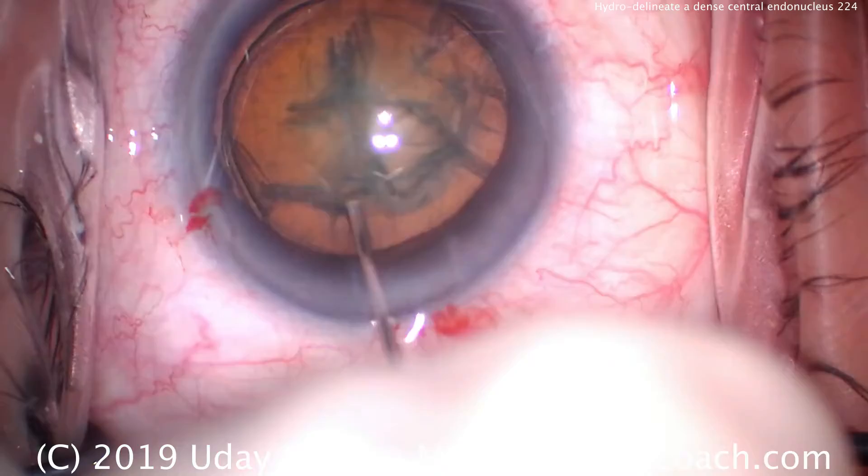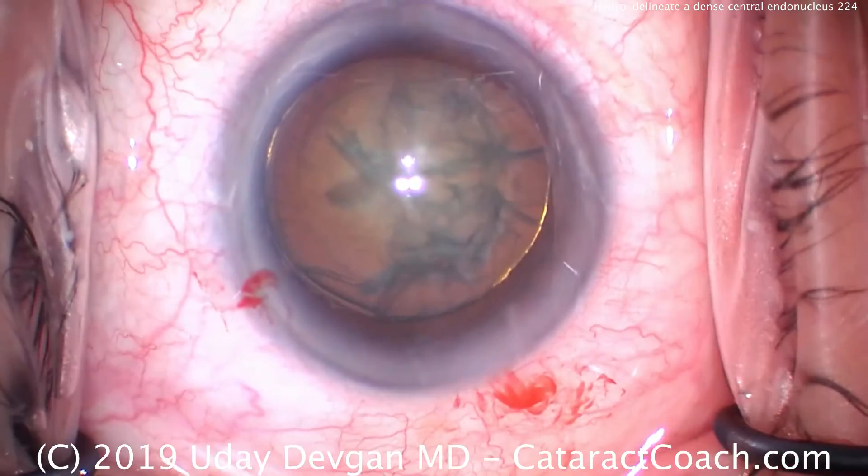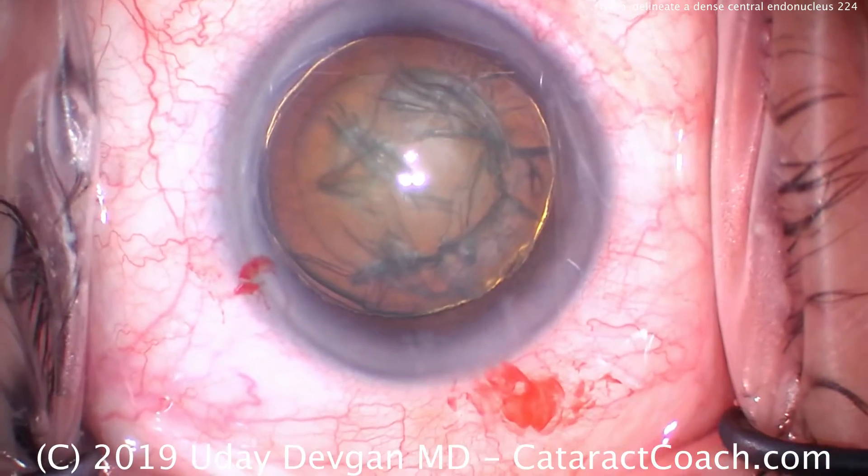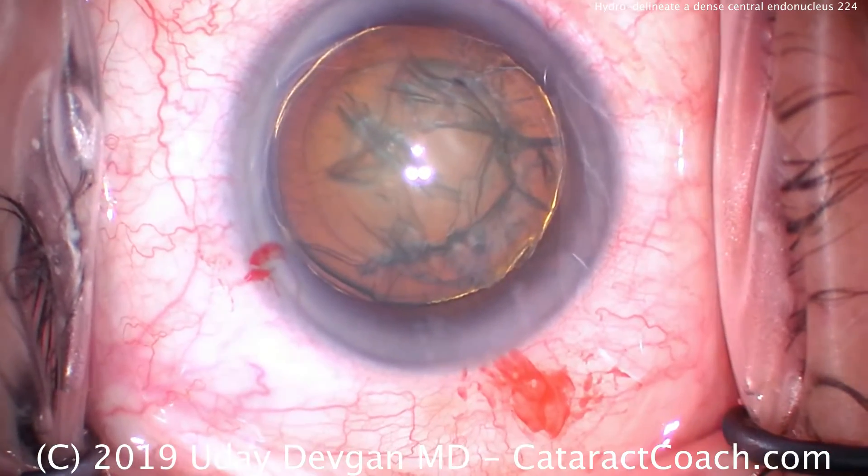There it is again. When you see that golden ring sign, you know you've delineated the endonucleus away from the epinucleus. A little extra viscoelastic there to protect the central corneal endothelium.